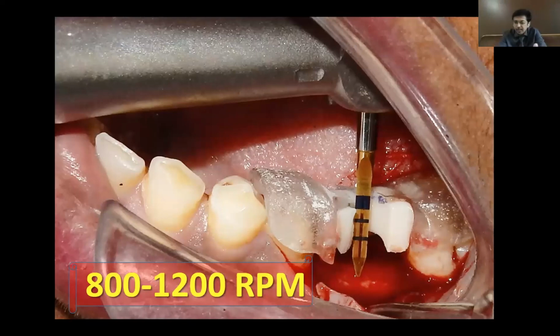Now this is where the problem starts. Such low RPM is not possible in the case of a rotor. The RPM is in lakhs. It is also not possible in the case of a micromotor because of the torque required for rotating the instrument.